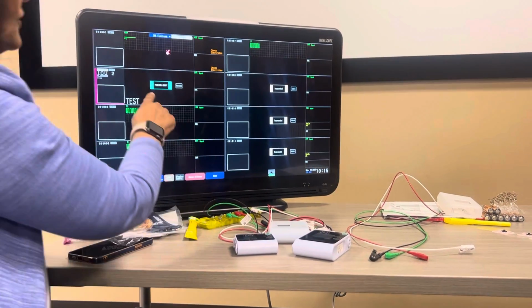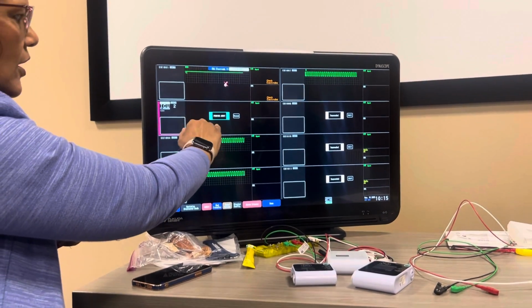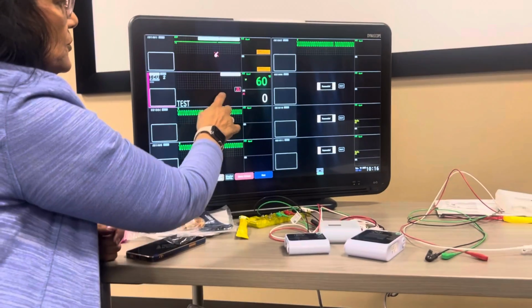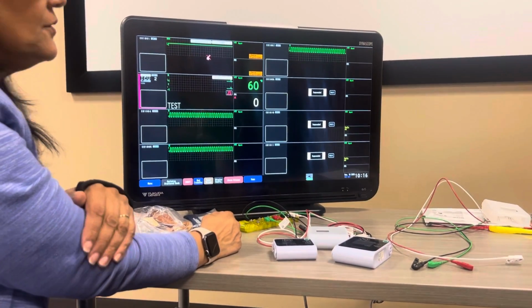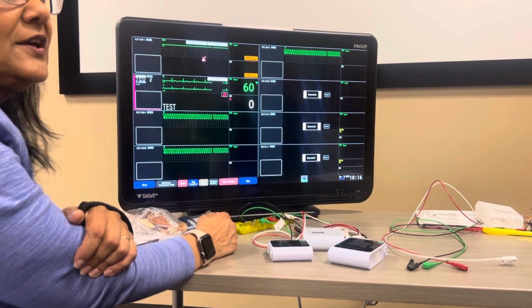So now when the doctor comes, they know where they're at. So if you went for a walk, it would say walk or whatever. So pending admit. Once you hook them up, you can come back and just hit resume. And then it'll just start. So you can do it ahead of time. Oh, cardio is going to be very happy for that. Okay, good, good.